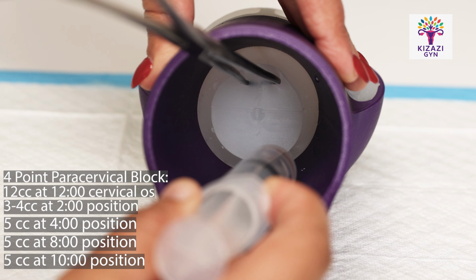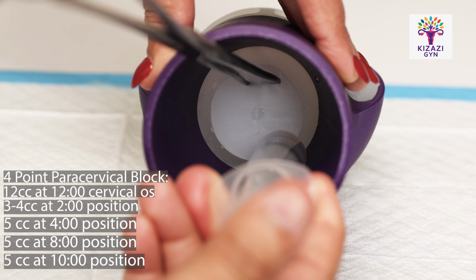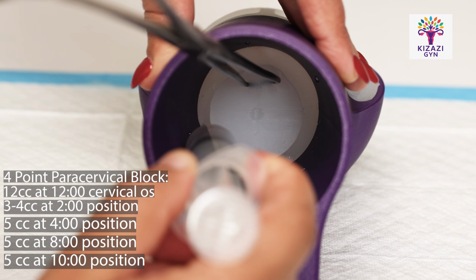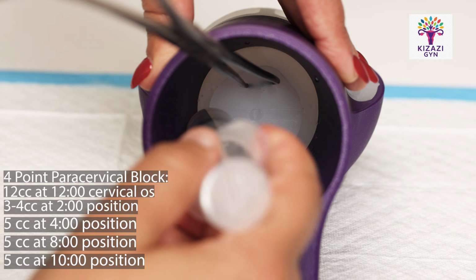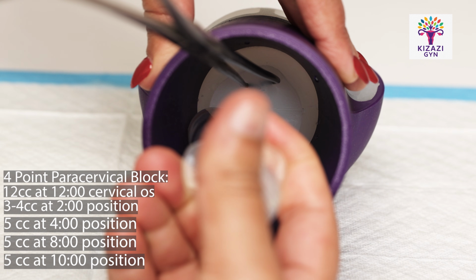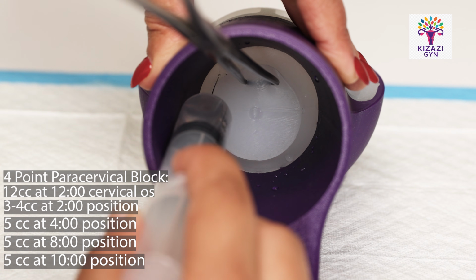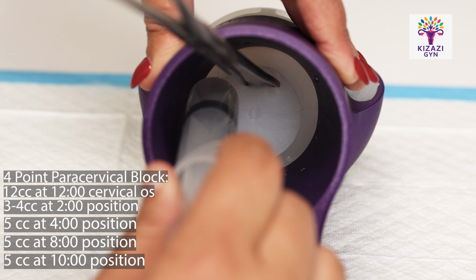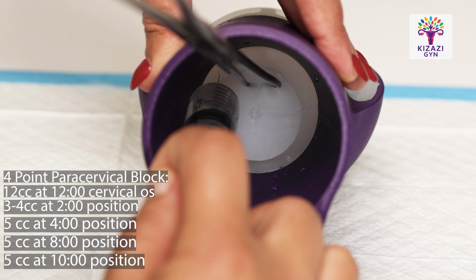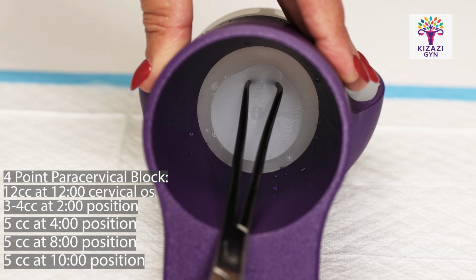Then you're going to inject at 4 o'clock again, insert 1 to 3 centimeters, aspirate, then you're going to inject. You're going to inject at 8 o'clock here, about 1 to 3 centimeters, aspirate, and inject. Then you're going to inject at 10 o'clock, 1 to 3 centimeters, aspirate, and then inject the rest of the 5 cc's. So you still do a total of 20 cc's, just spread out a little bit. And that's your 4-point paracervical block.